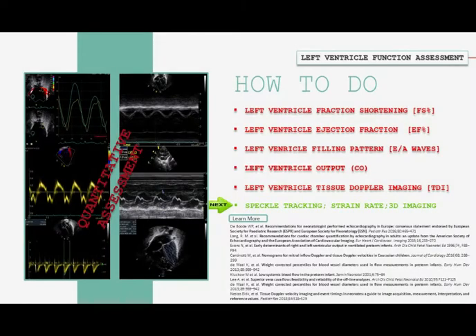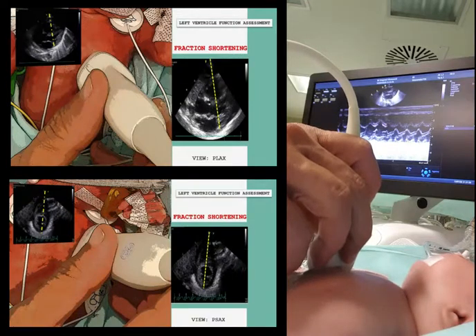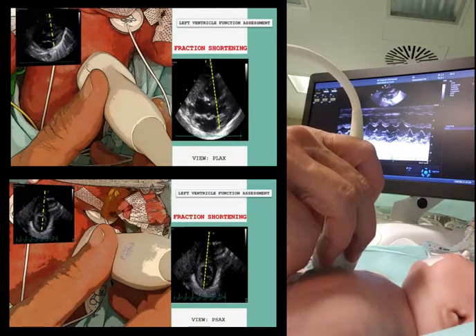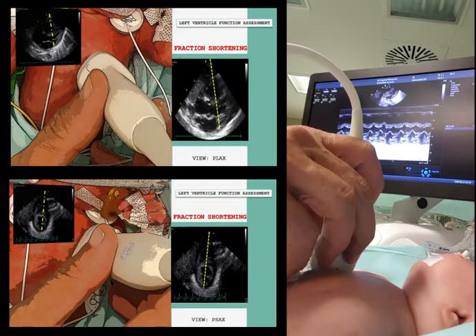This information can, and probably should, be complemented by an objective assessment of left ventricular function. The most commonly used parameters to assess left ventricular systolic function are measurement of fractional shortening and ejection fraction.